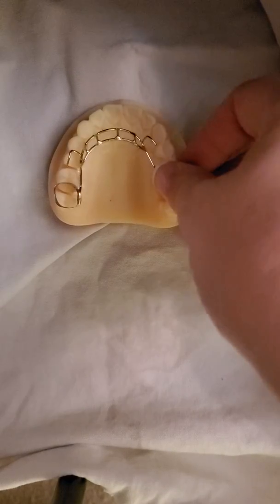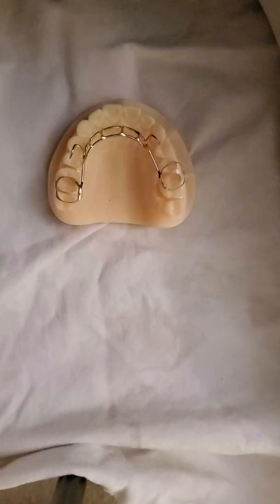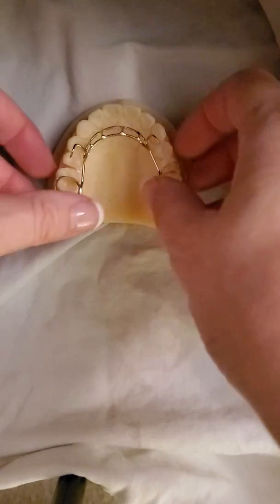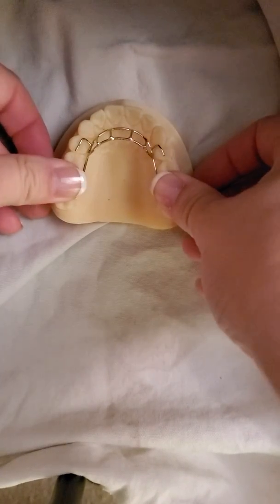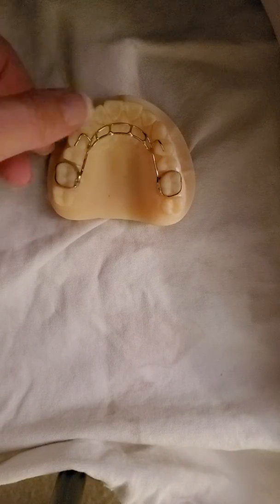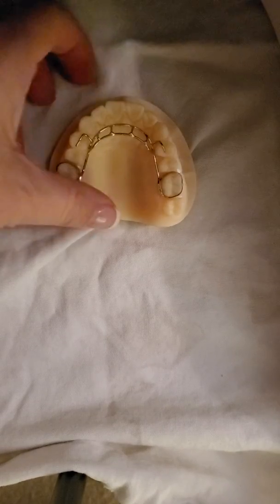Make sure your bands are fitting well. Most of these labs, like Ollendorf, who gave us this sample, do a great job fitting bands, so you don't have to fit or stock them yourself. But you should have really well-fitting bands, okay? Put a thin layer around it, smush it down, wipe the excess off, and light cure. Real easy, right? Okay. So that's pretty much it.